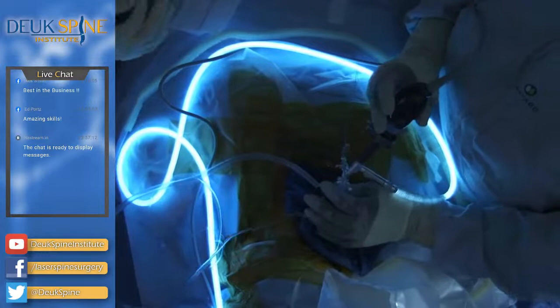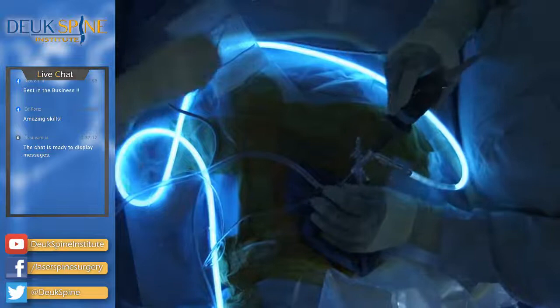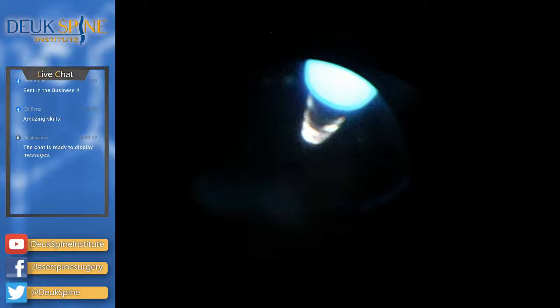And every one of these patients virtually that I see has had their injury for years, and all those years of inflammation have led to the disc being damaged more, leads to degenerative discs. Okay, there's another piece of herniation. Maybe I can float this one out. Floating saves time. As Pennywise says, they all float. Oh, look at that piece of herniation. It's beautiful. So we're getting like a bunch of chunks right now. This patient's going to be so happy when his surgery's over. And we're going to do another testimonial. One of 1,000 that we have.